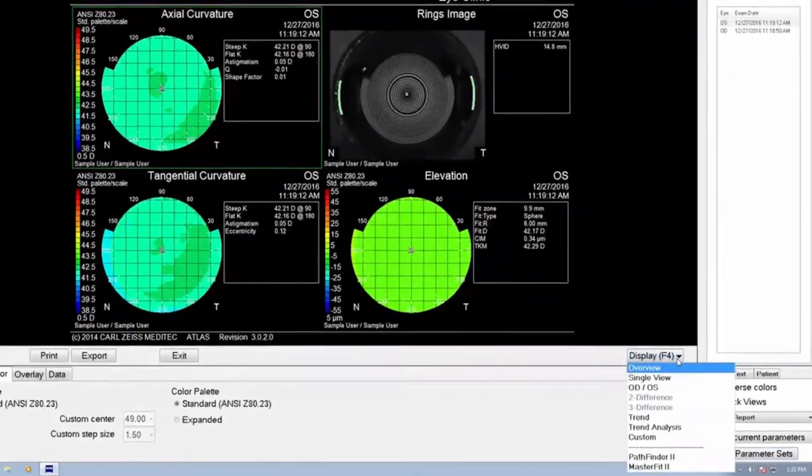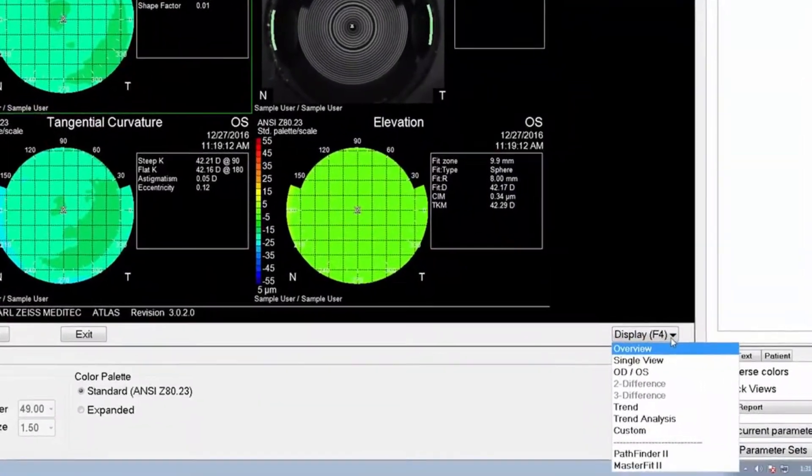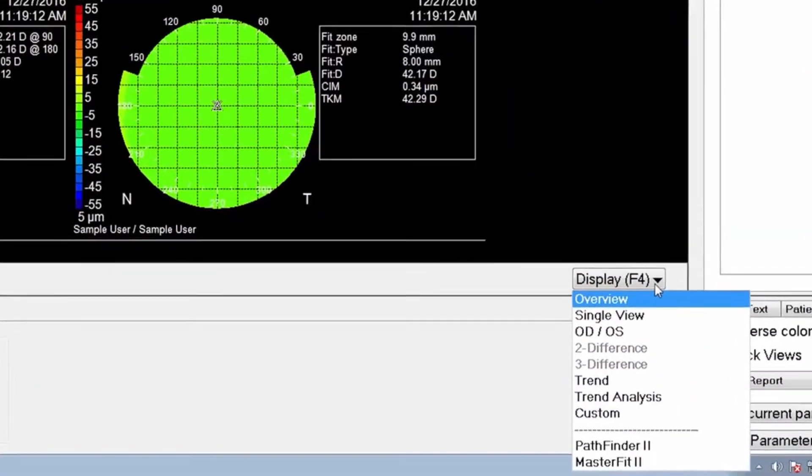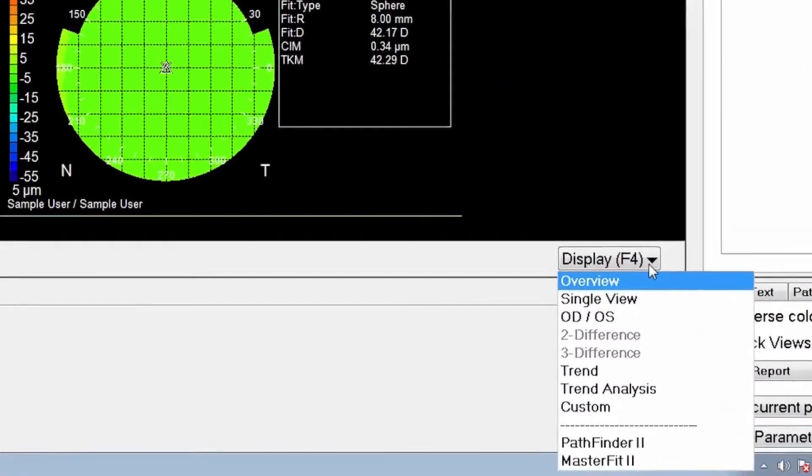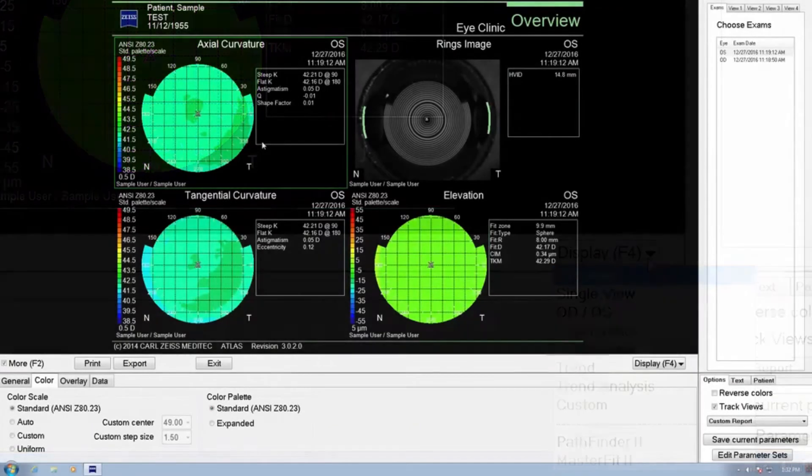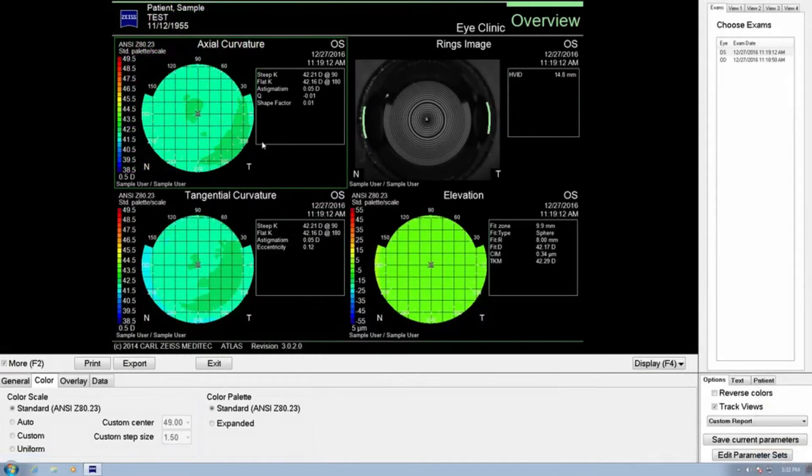To change views, press the display button and select the desired clinical view from the drop-down menu. Using the overview map for our example, the map is divided into quadrants.